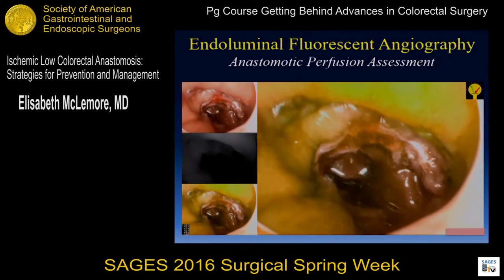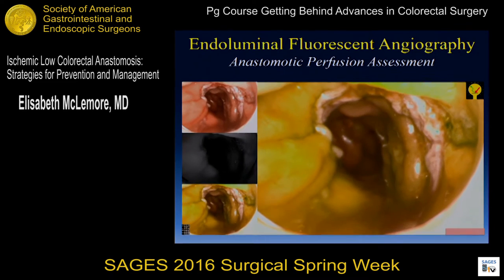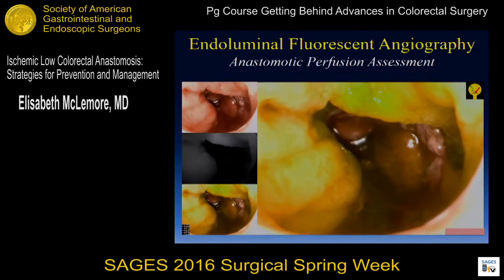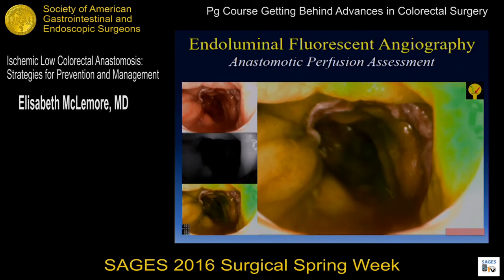But you can see that the rectal area is perfusing before the colon. Most of us would say that's reverse. So what's going on here? Any ideas? Thankfully, this one's salvageable. That'll give you a hint. And then all of a sudden, we see a little bit of a later perfusion in that proximal colon.